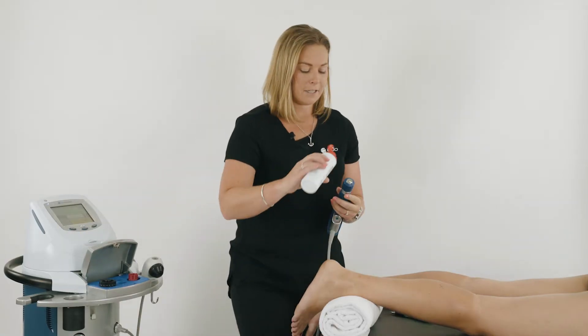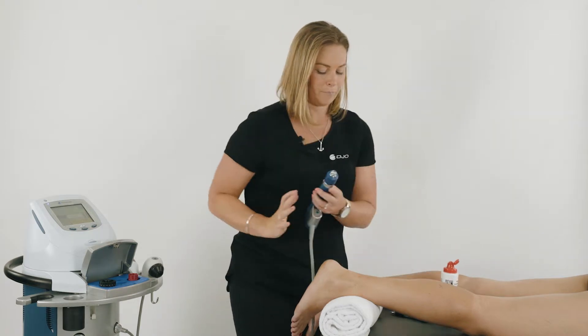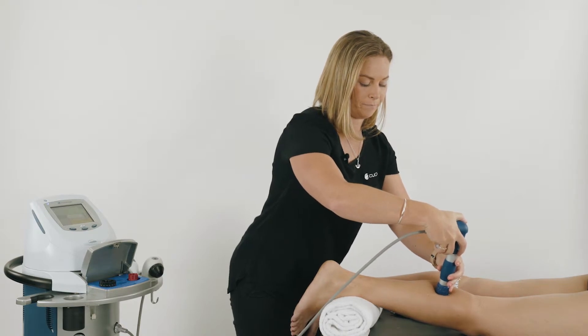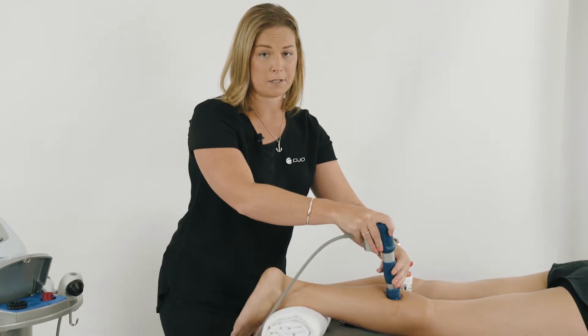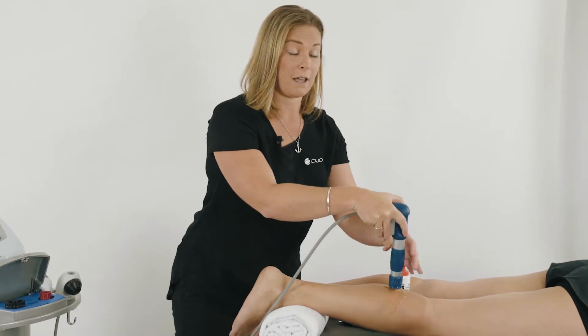Using gel this time, apply to the areas of the trigger point. You want to use small circular movements while doing the treatment and identifying with the patient where the pain or discomfort is experienced.